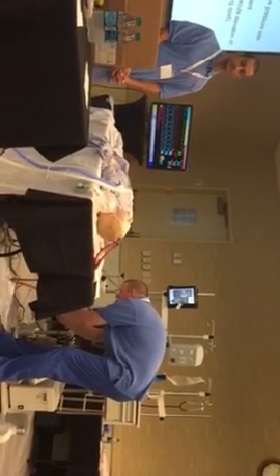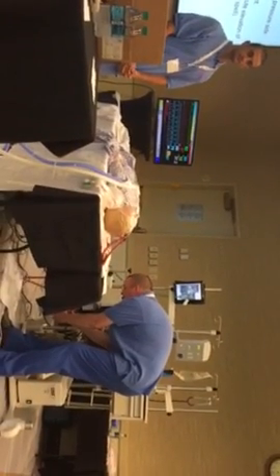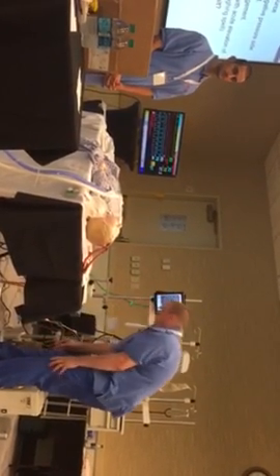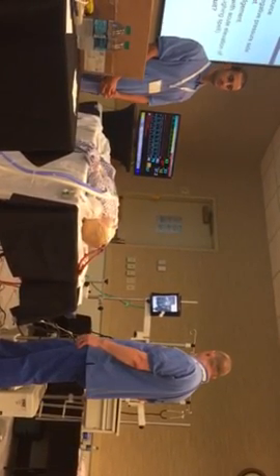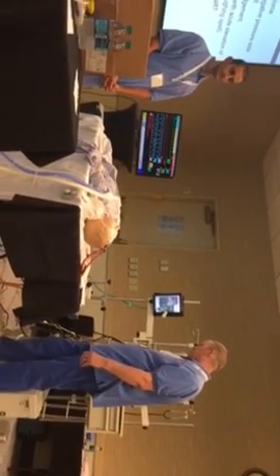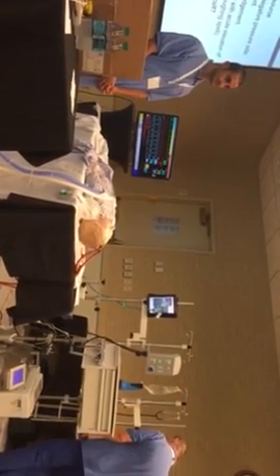So what did you notice in this situation? What was happening here as you were watching air come down the venous line with your system? Well, it starts out as a trickle, but if I would have gotten that cap off faster, maybe it would have. Then it became a big bolus that was just sitting in the column. Yeah, with each cough, it got bigger. Was the oxygenator able to handle the air that was going to it? Was any coming across the arterial side? No, I didn't see anything on the arterial side. But it did get trapped in the column.